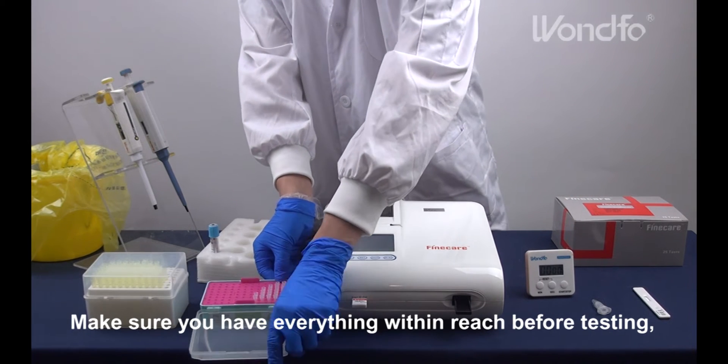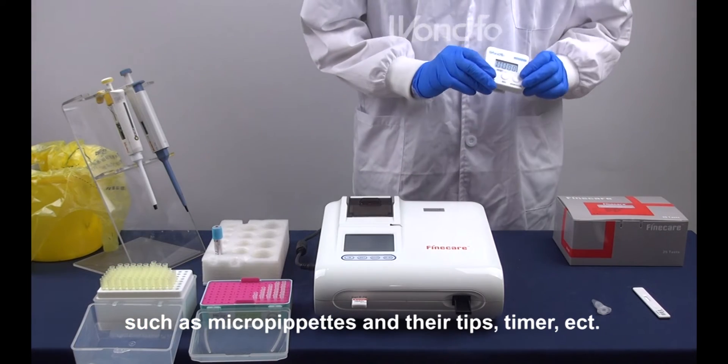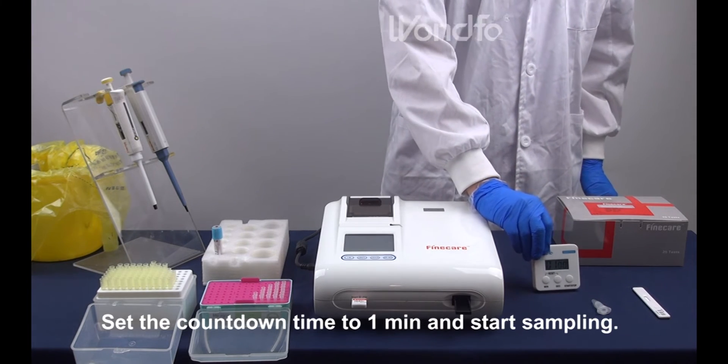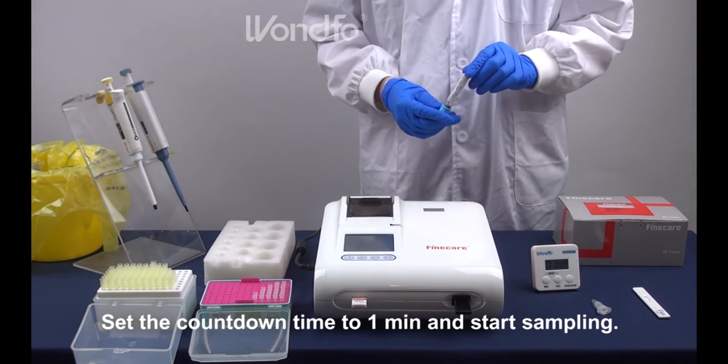Make sure you have everything within reach before testing, such as micropipettes and their tips, timer, etc. Set the countdown time to 1 minute and start sampling.